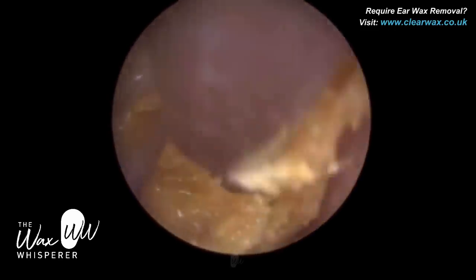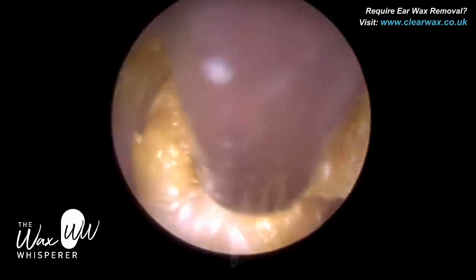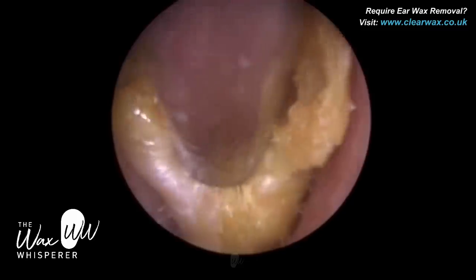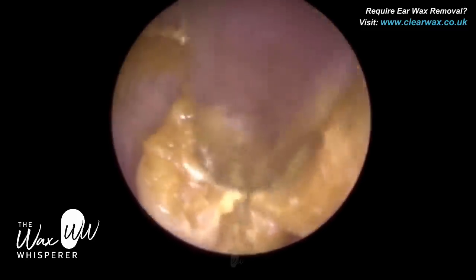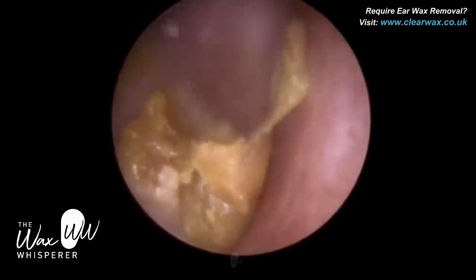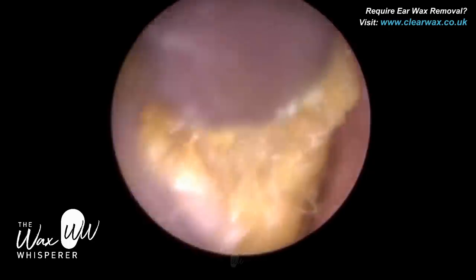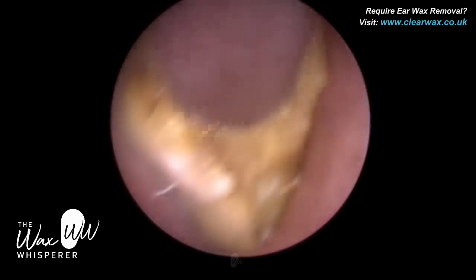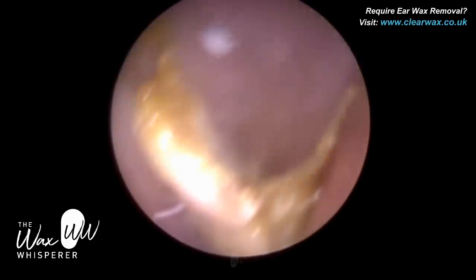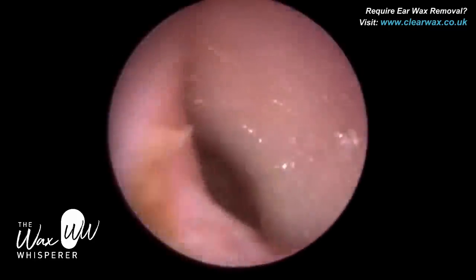So when I do remove it, it comes out in larger chunks, which is always helpful. Again, just at the base of the ear canal, I'm trying to lift this off the canal wall. Now on the posterior part — the back part — of the ear canal. This is the anterior part of the ear canal, which is the front part. I've just gone back to the floor of the ear canal. The top part of the ear canal we call the roof, or the superior part of the ear canal.